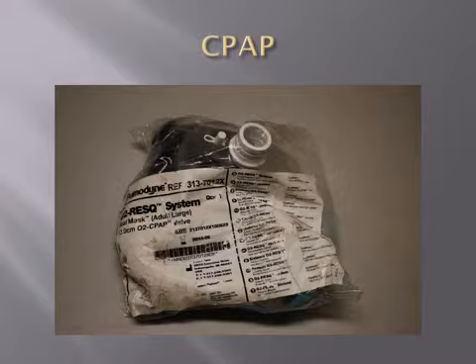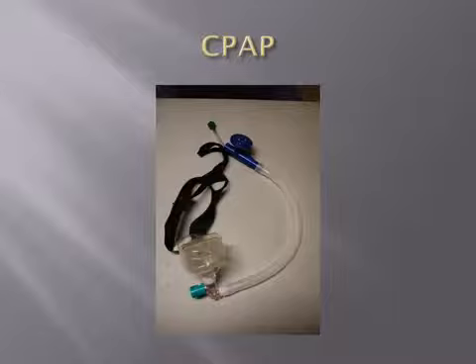Now to use the device. This is the packaging of our CPAP. When you open up the package and lay the CPAP device out, this is what it should look like.